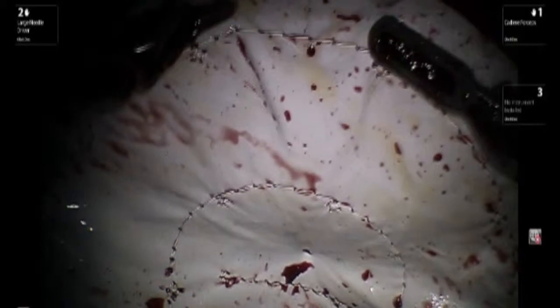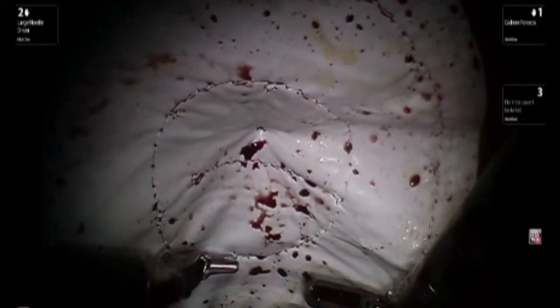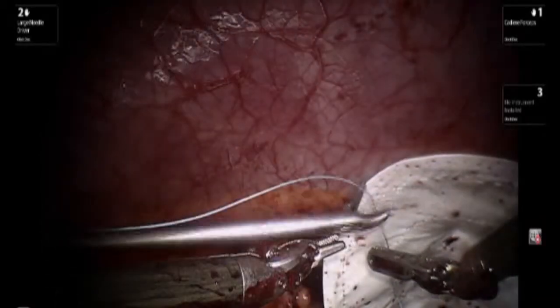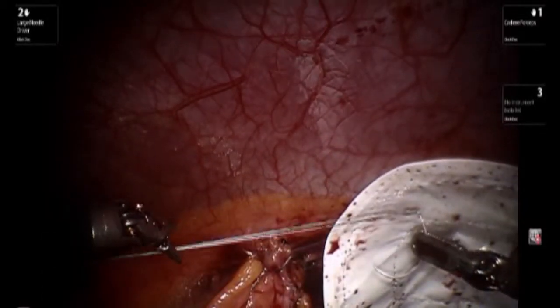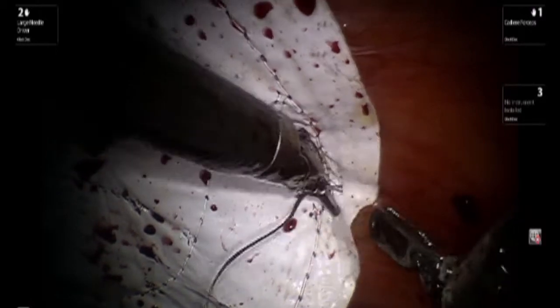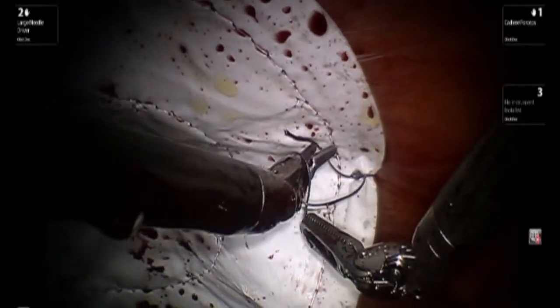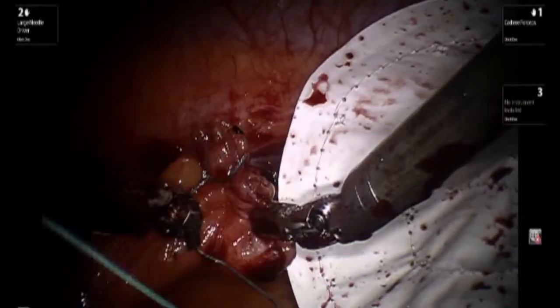One can see that the mesh is now lying nicely and not moving around. We will first place a stitch at the two opposite halves of the mesh and progressively begin suturing — first the portion of the mesh closer to the camera, as this is more challenging, and later the portion of the mesh that is away from the camera.